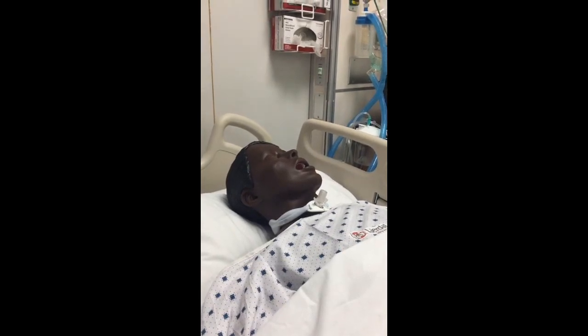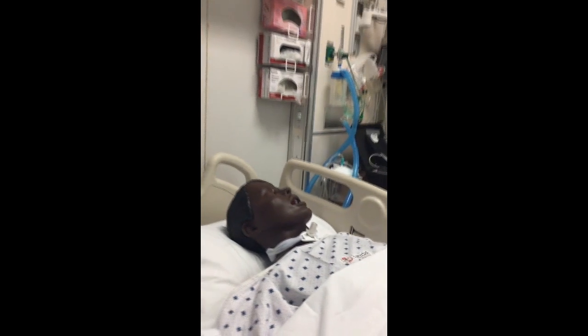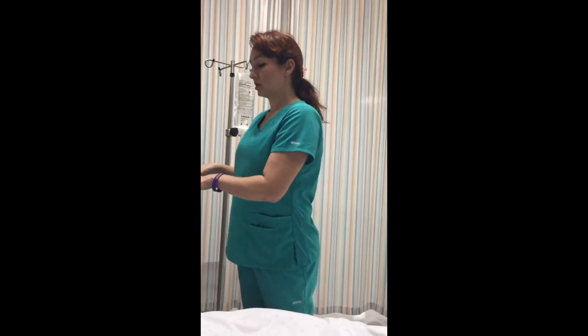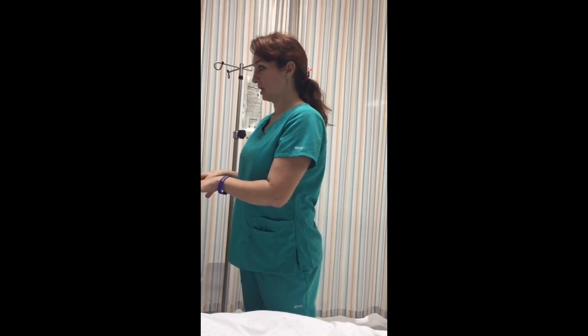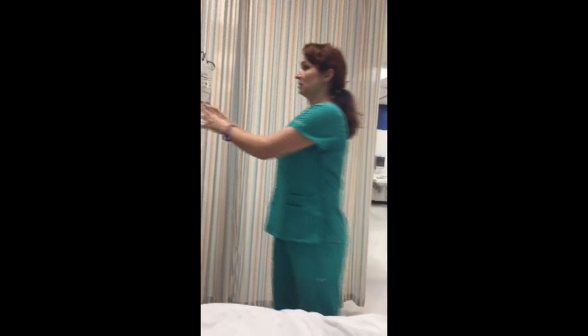This is a demonstration of blood transfusions. Hi, my name is Summer, I'm going to be your nurse. I have a physician order to transfuse two units of blood — packed red blood cells. I'm going to check on the computer and in your chart to make sure that the consent has been completed with you by the ordering physician. It looks like it's there, so make sure you don't have any questions.